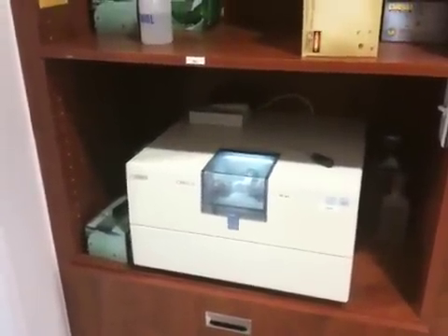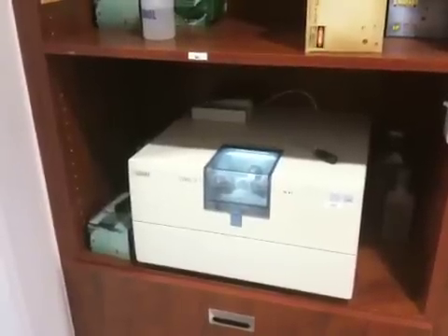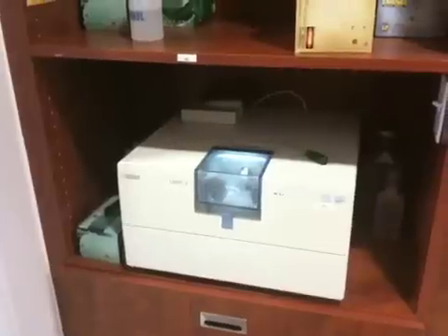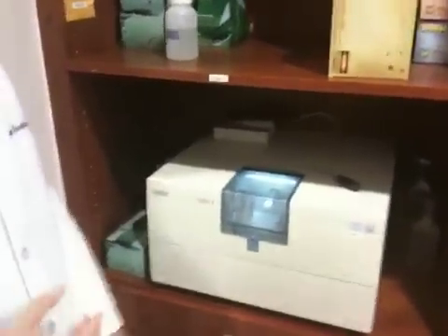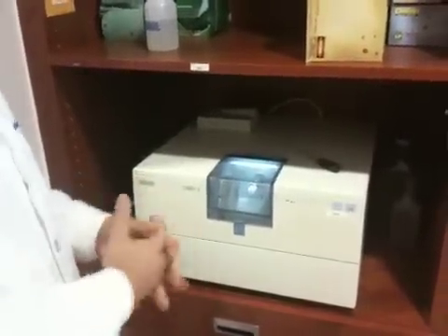Incidentally, they have a couple of these machines here in the office. This one is named C-3PO, and the other is named Chewbacca — just their local office network names. What's the generic name of the machine? It's called CEREC. I don't know exactly what that stands for, but CEREC.